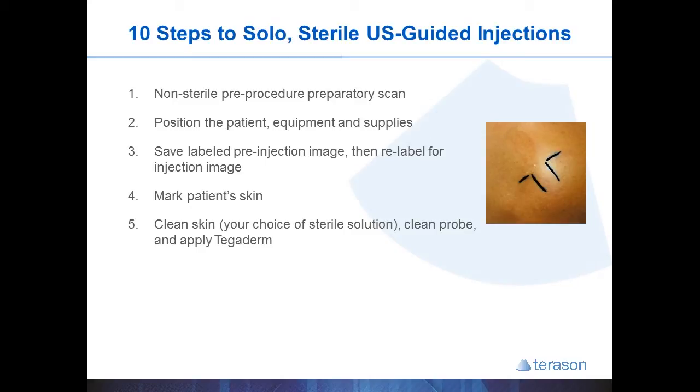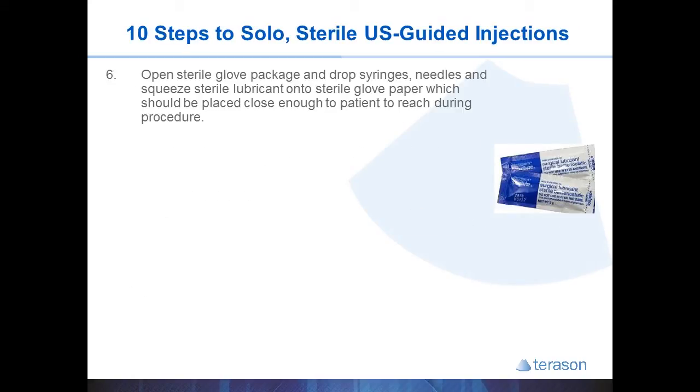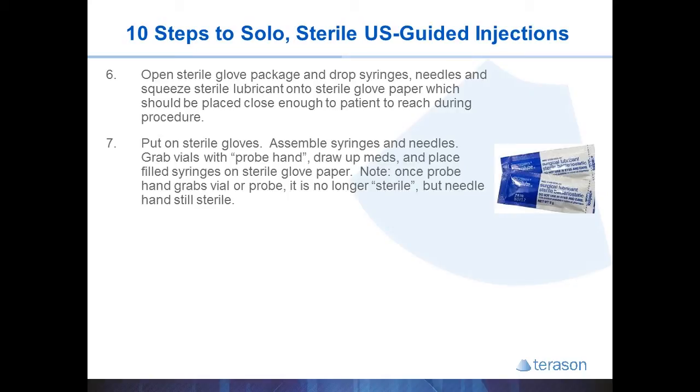That way it's easy to obtain your target image the second time. You can then clean the patient's skin with iodine or chlorhexidine, clean the gel off the probe, and place a Tegaderm strip onto the probe. You then open your sterile gloves and drop your syringes, needles, and squeeze some sterile gel into the sterile glove paper. Wash your hands, put on your sterile gloves, and assemble your needles and syringes. Then remember which hand is going to use the probe — that becomes your non-sterile hand from this point forward.